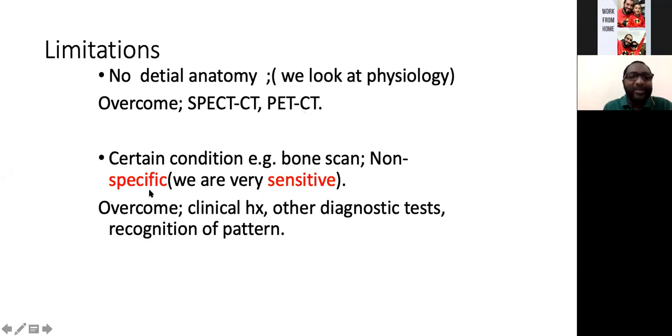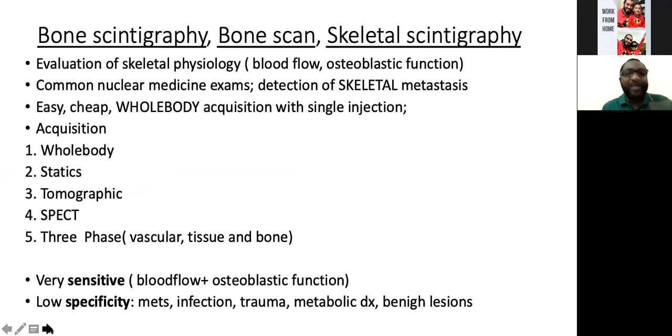With each of these points, you are raising your specificity so that at the end of the day, when you are putting up your bone scan report, your report should be 100% sensitive and close to 100% specific, depending on your expertise and your experiences. So the idea of reporting a nuclear medicine bone scan, like I always say, is struggling to increase your specificity, which I will discuss with you subsequently.